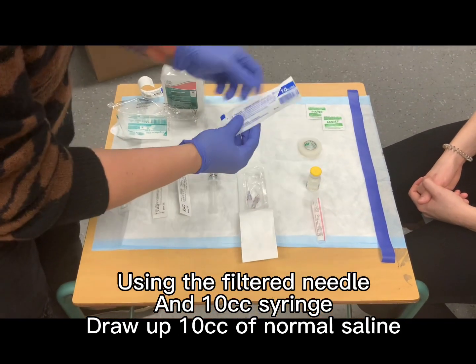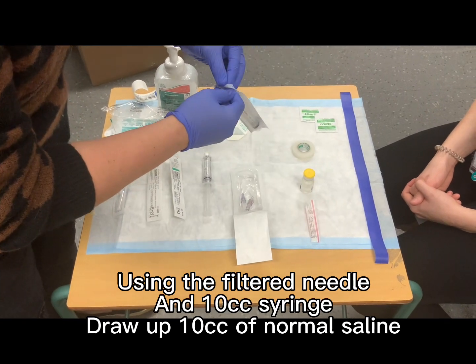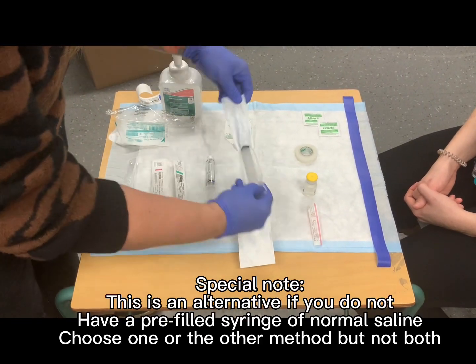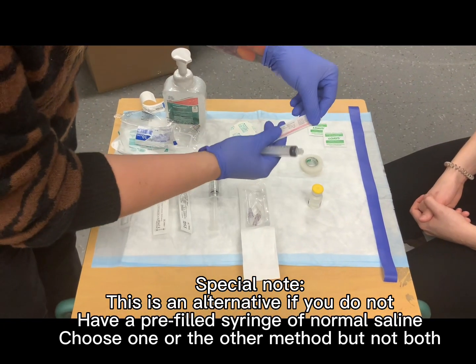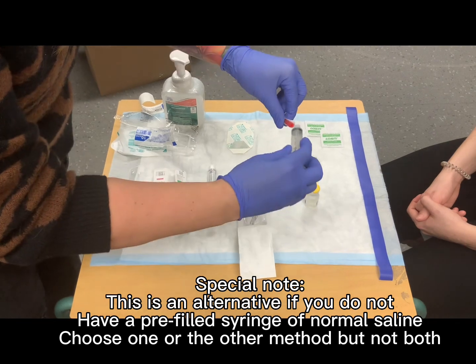If you do not have a pre-filled syringe with normal saline, you can build one yourself. Use a 10 cc syringe and a filtered needle. Push the filtered needle through the paper side. Screw it together.